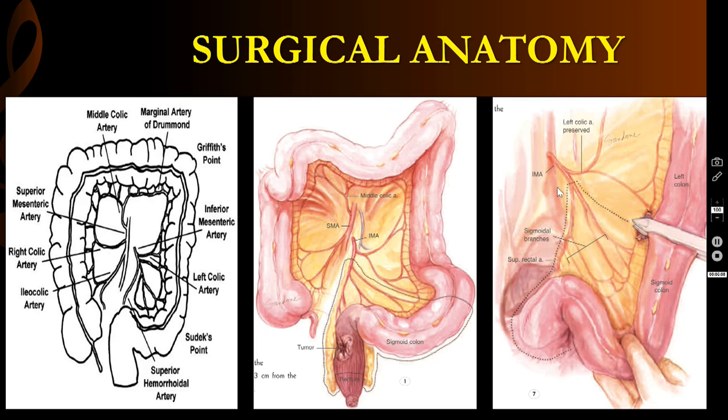laparoscopic anterior resection, usually we will be doing it outside the body, that is extracorporeally, after pulling the divided rectum and sigmoid colon and part of the descending colon outside. We will be doing it outside the body.